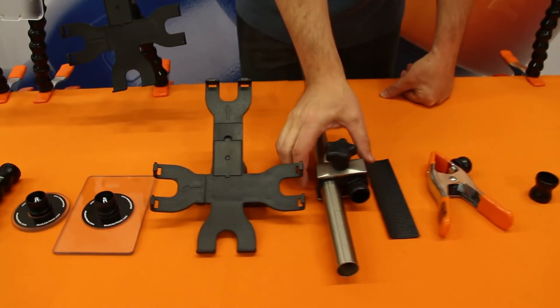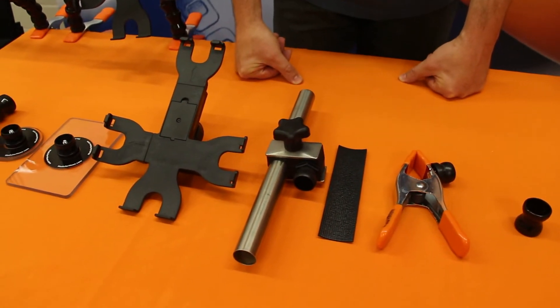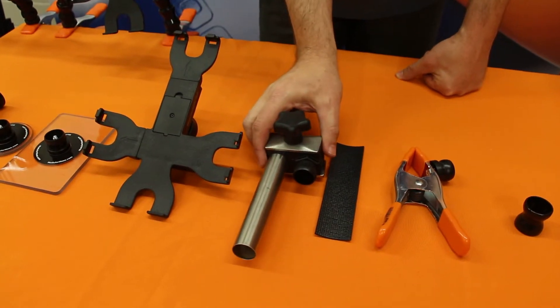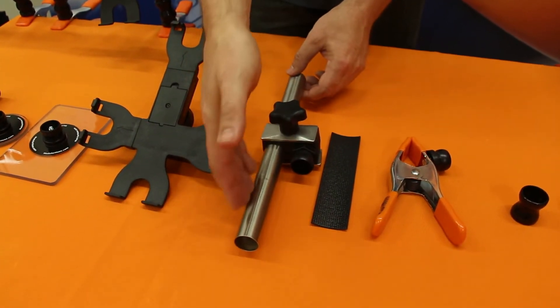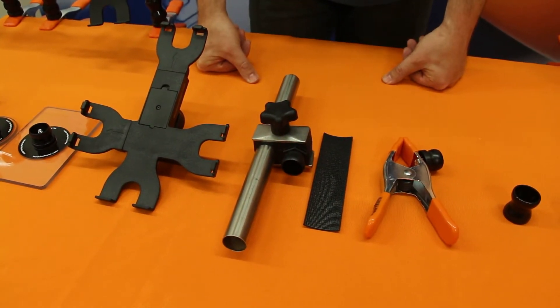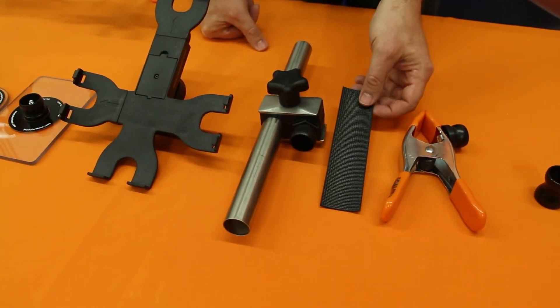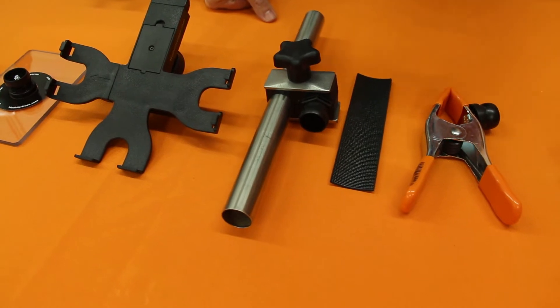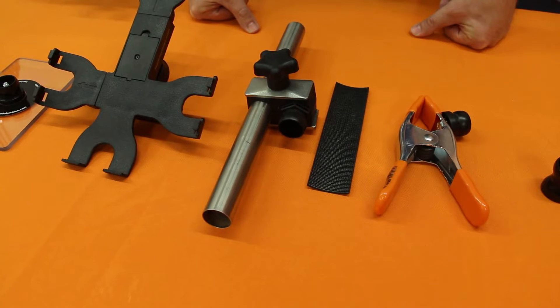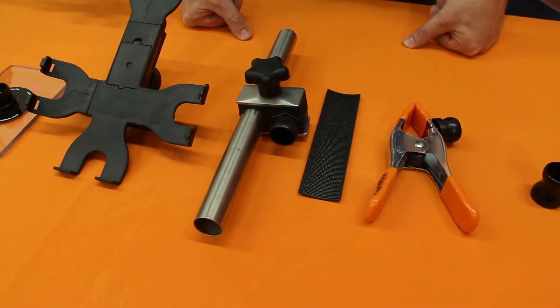The next item is our tube clamp kit. A lot of wheelchairs don't have a good flat spot for mounting spring clamps, so as an alternative we have this tube clamp. This would clamp onto the tubing of a wheelchair or a bed. It works ideally on one-inch or seven-eighths inch tubing. An insert is included that you can wrap around the tubing to build up the size if needed. It will not work well on tubing that's really small, like a half inch.